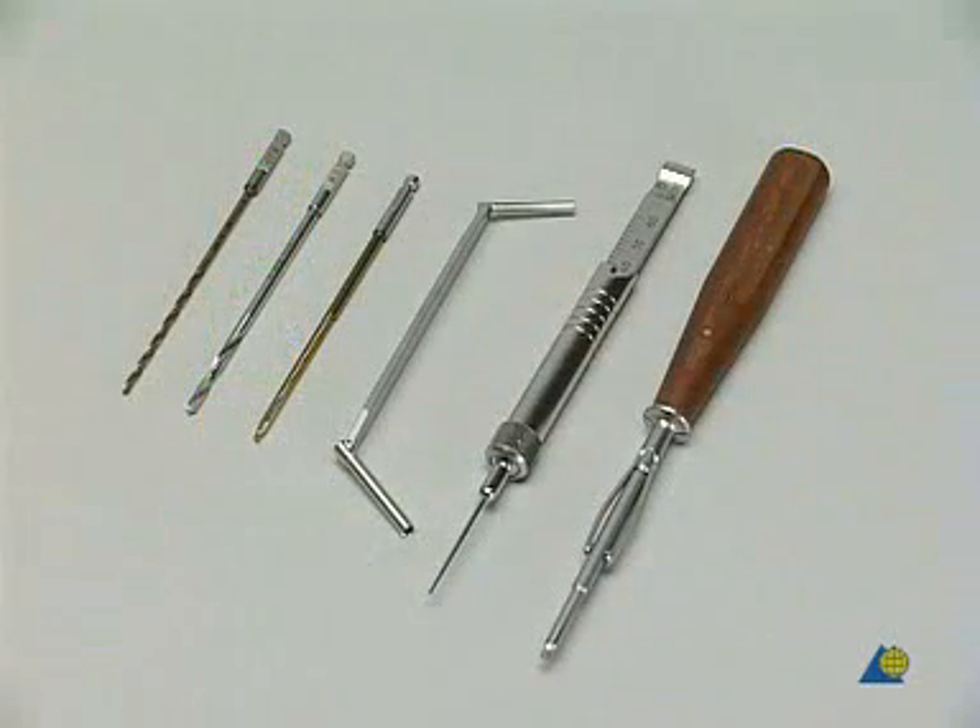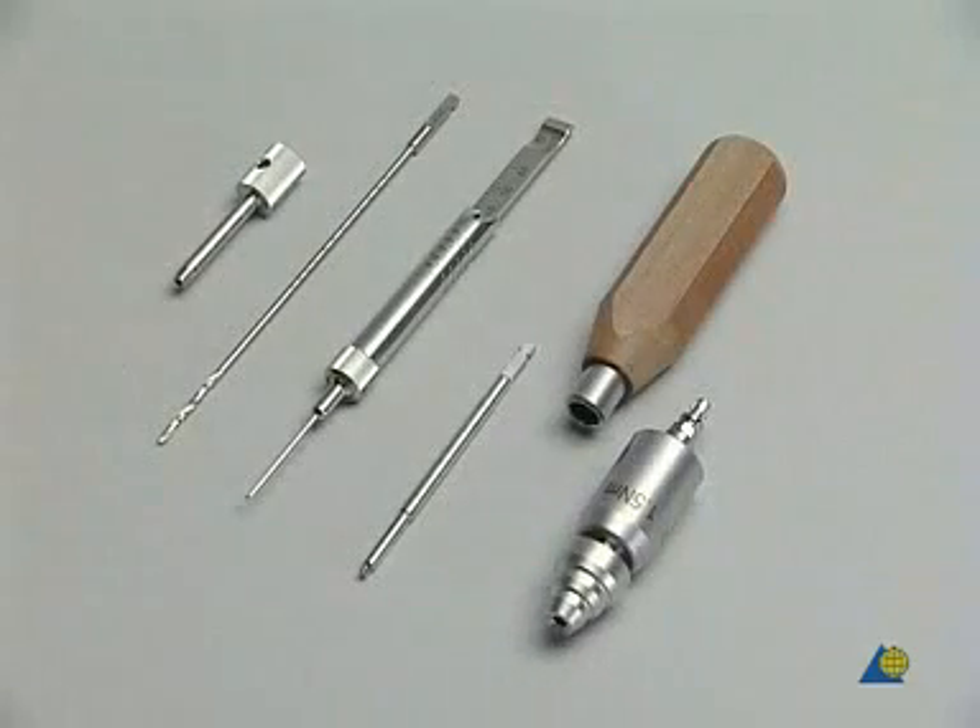To insert the lag screw, the 2.5 millimeter and 3.5 millimeter drills, the 3.5 millimeter tap, the 3.5/2.5 double drill guide, the depth gauge, and the small hexagonal screwdriver are required. To insert the locking head screw, the following instruments are available: the 3.5 LCP drill sleeve, the 2.8 millimeter drill, the depth gauge, the screwdriver shaft, the torque limiter, and the handle.